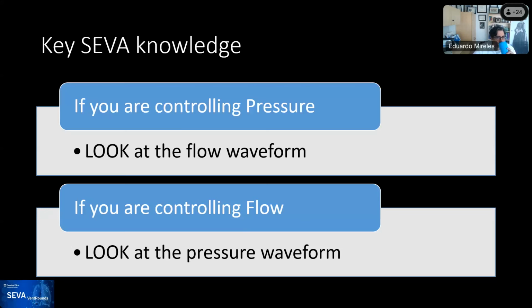Yeah, if you were listening closely, Eduardo said you only control flow during inspiration in volume control. What he didn't say is that expiration is always pressure controlled. Correct. In the current modes available in the market, I only know of one mode that Ariel Garnero sent to us about, this FCV, that controls flow during expiration.